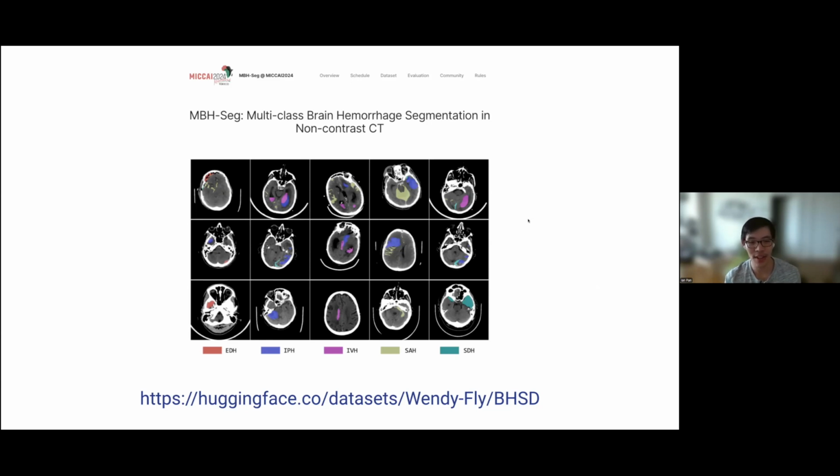But I show this because it's an example of how we can enhance existing, publicly available data for future tasks, right? And so something I'm working on now is using this data set to try and automatically segment all of the hemorrhage cases in that data set. And that way, instead of just having a model that says, here's hemorrhage in the CT, here's hemorrhage on this slice, it actually shows you where it is. And that can be more helpful in getting radiologists to use it, to trust it, and to buy in.